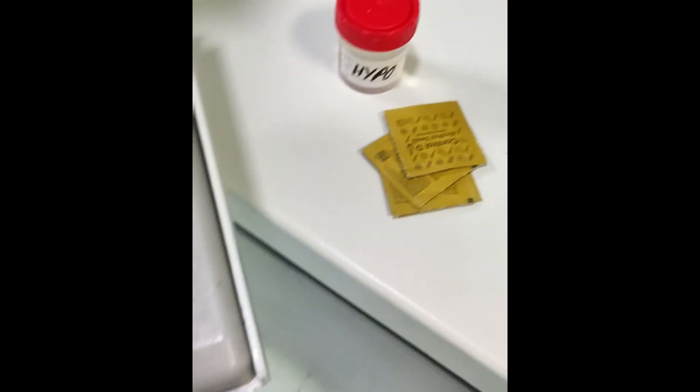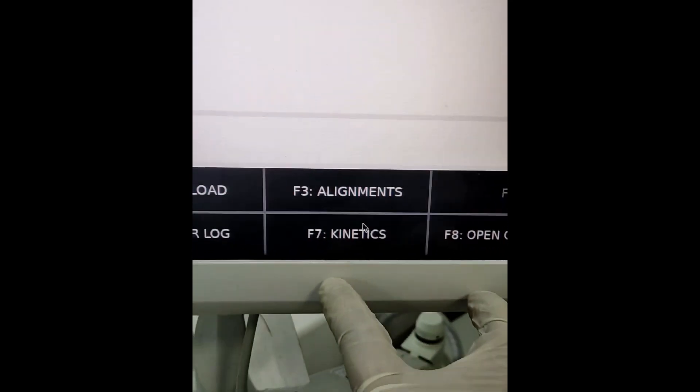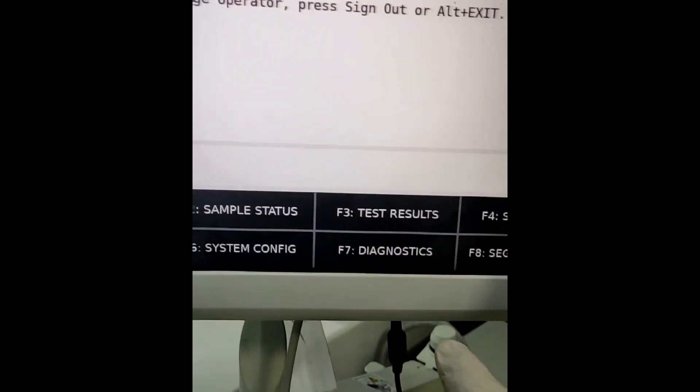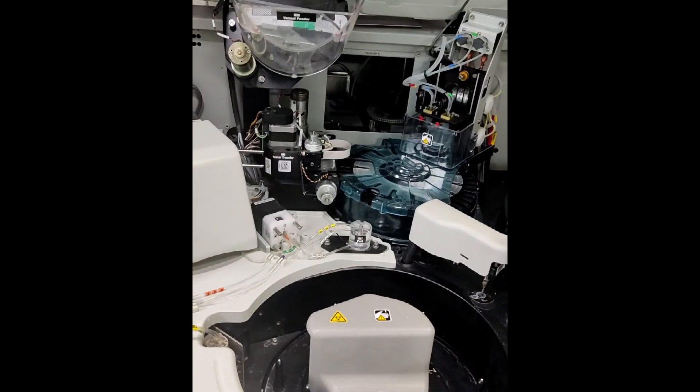Next we have the probes and sample tray holder cleaning, for which we arrange hypochlorite solution and an alcohol swab. To begin with external probe cleaning, we go to System Prep and then click Daily Maintenance.